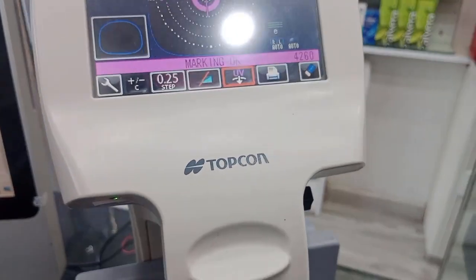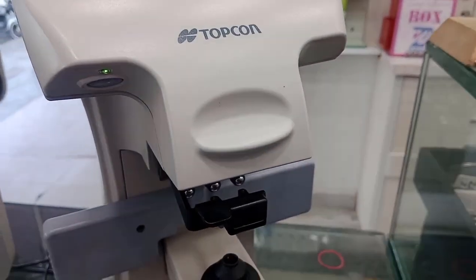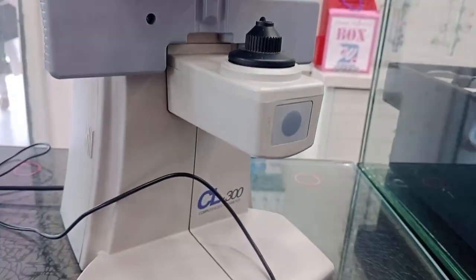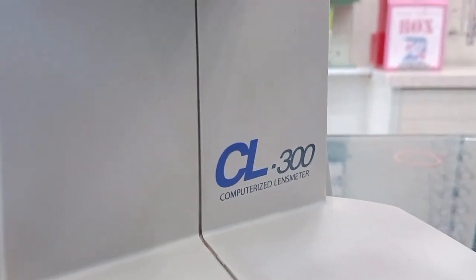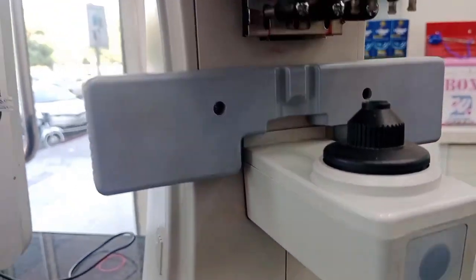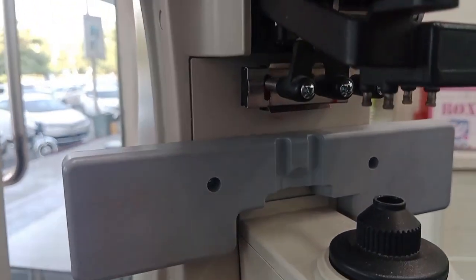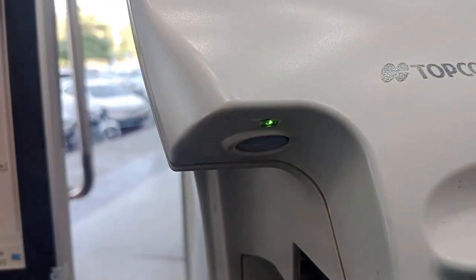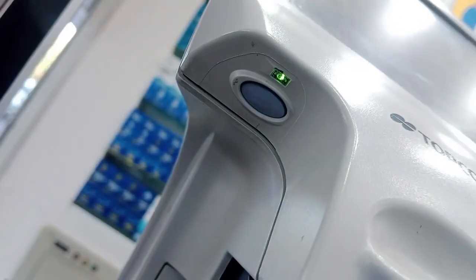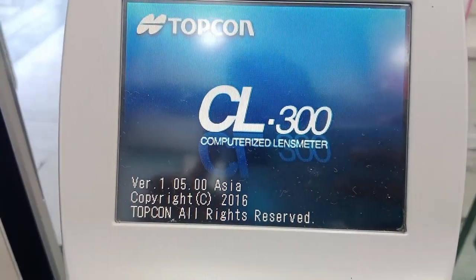This is the Topcon digital lensometer and these are its different parts. The model number is CL-300. This is a computerized lens meter and you can see the different parts of this digital lensometer. This is the screen. The red light is on, meaning our lensometer is off. When I press this button, the green light comes on and our Topcon digital lensometer is switched on.